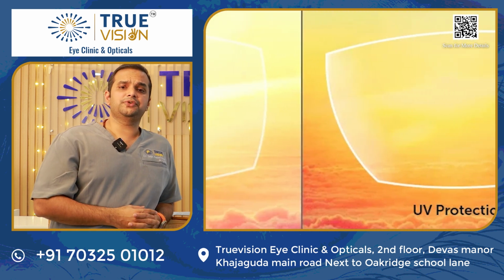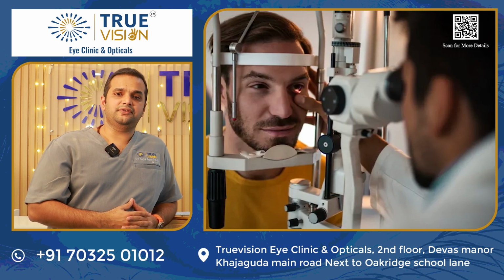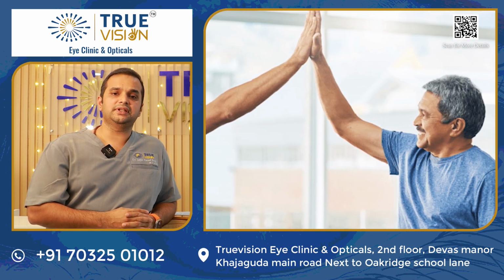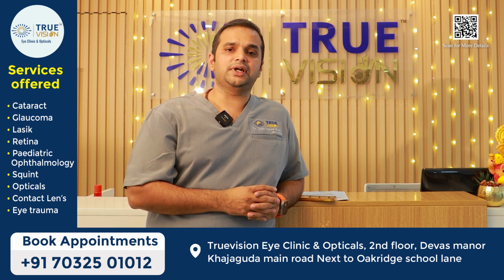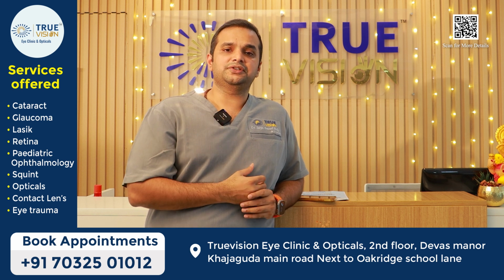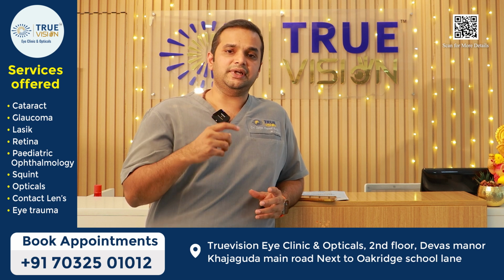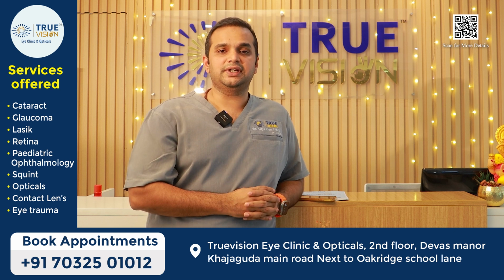So whenever a patient comes to me for cataract surgery, I always have a free and frank discussion about all the different lens types with them, and I encourage my patients to come back to me with questions regarding these lenses, because once we decide on the lens, we have to understand that the lens implantation is permanent. So always make sure that you have gone for the right kind of lens for yourself. Once the lens is fitted into the eye, it is very difficult to replace it or exchange it. So always take the right decision when it comes to your lens.